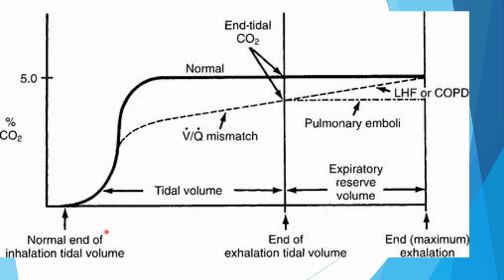And these are some abnormal things you might see on it. So in here is our normal, it goes up. What's going on here is somebody with a long time constant. So they have a mismatch, slow emptying.